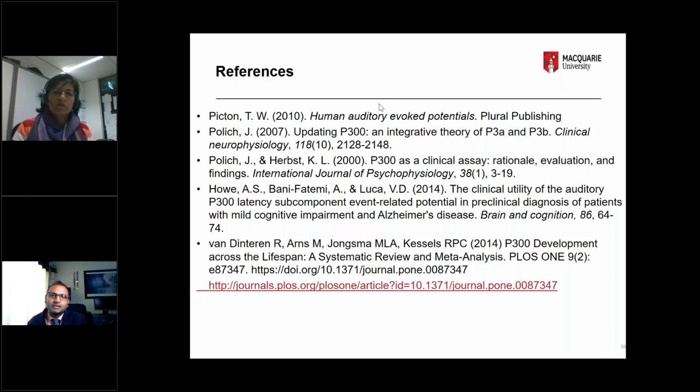And I wonder whether this sort of task can give an objective evaluation of what they're experiencing, and that is very important for closure for a person when they have a real problem which only started in their adult life, and they've been told from one professional to another that everything is fine, your ABR is okay, your PTA is fairly okay, so you should not have it. Your speech understanding in noise on our tasks is okay. If you can pinpoint that there is actually an objective problem which we can find, I think that gives a great sense of closure to the individuals, and that works really well for their rehab.